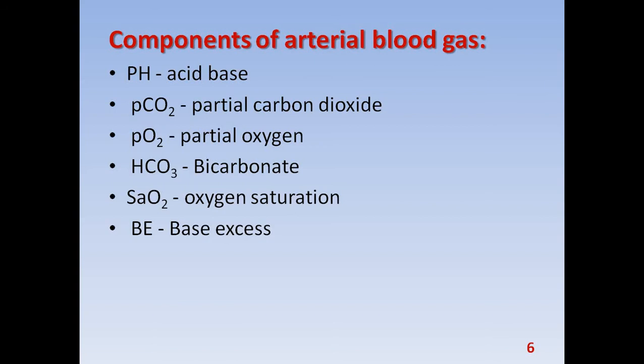First one is pH, to see the acid-base status, and the second one is the partial pressure of carbon dioxide. The third one is partial pressure of oxygen. Next one is bicarbonate. Fourth one is oxygen saturation, and last one is base excess.